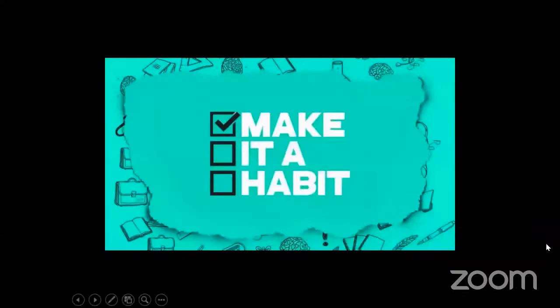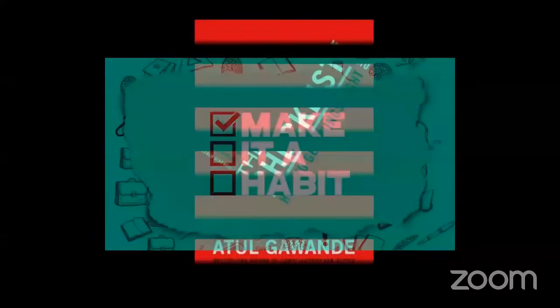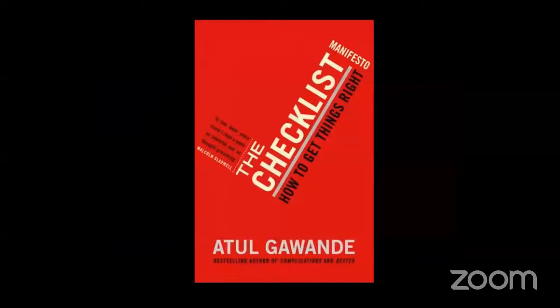So make it a habit. When you make something a habit, it is said, that's one less decision that you need to make. So when you apply that to shoulder arthroscopy, make it a habit to go around the shoulder, have a checklist of the points that you will make a note of, because your MRI may say anything. You may have made a decision about what surgery to make, but you don't want to be left with a surprise. And that's why having a checklist, going through those points of interest will always benefit you.